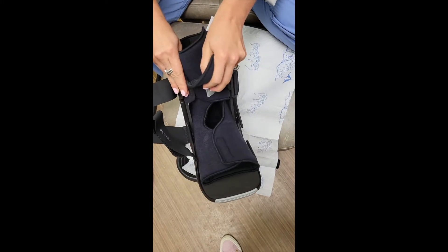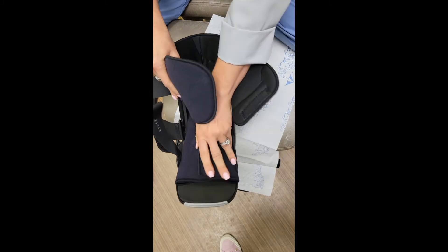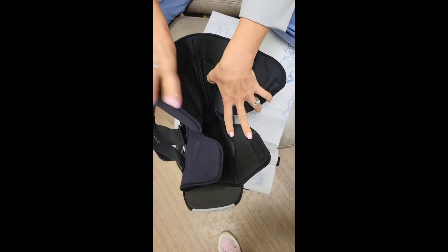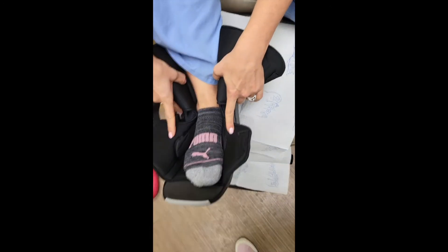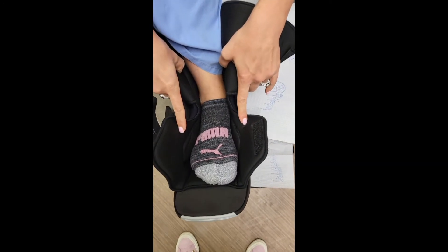You'll then open the soft cushions and you're going to place your foot in the boot and make sure your heel is all the way at the back.